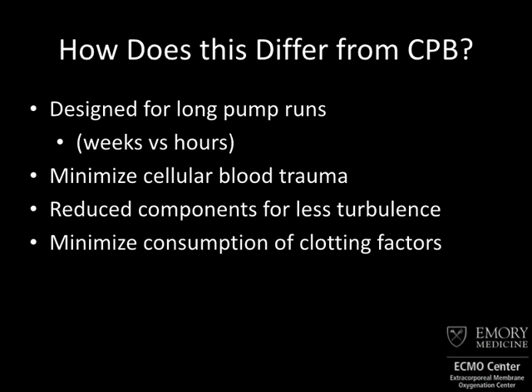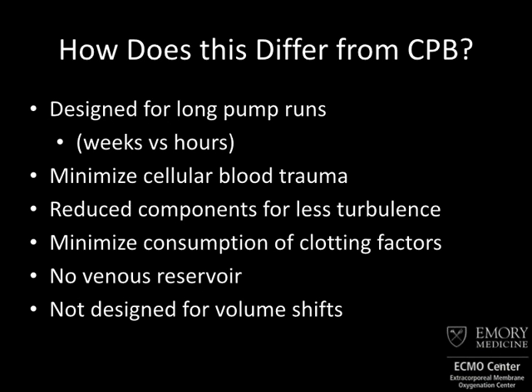So when you go on bypass in the operating room, you create a lot of turbulence to the blood. You eventually wind up with hemolysis. And what we're doing is trying to reduce the amount of blood trauma that occurs. And the way we do that is essentially by reducing turbulence. So the pumps are more smoothly designed, laminar flow is focused upon, anything that has a sharp right angle is removed. All of that is taken care of, in addition to the fact that we use different materials in the actual pump. This results in less consumption of clotting factors and enables patients to remain on support for long periods of time.